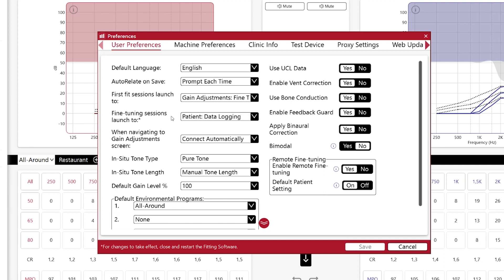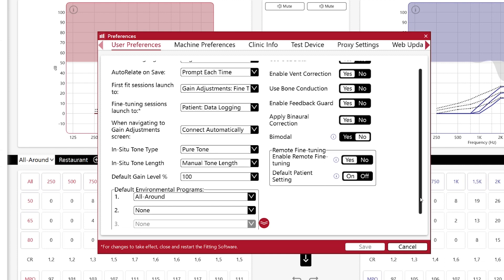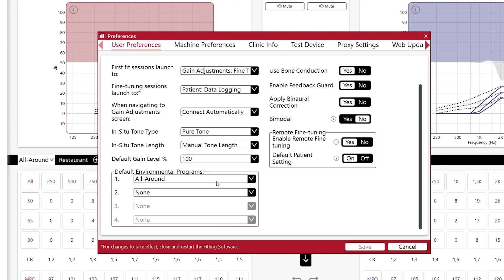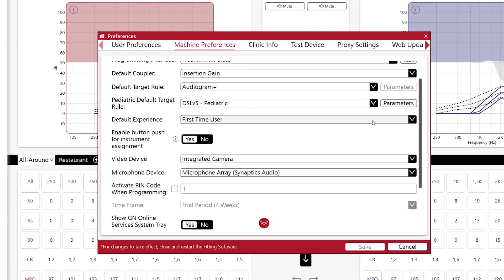And this is a new feature in SmartFit 1.16, which I really like. Here, you can define the default number of programs that you want to start with. And in my case, I only have one program, which is the all-around, but you may have other preferences.